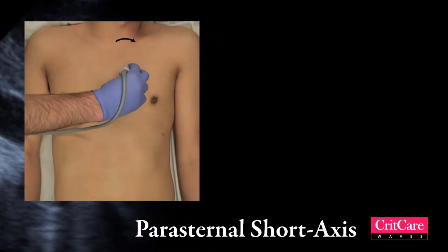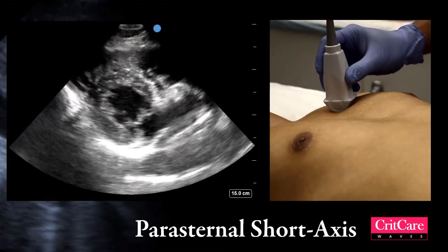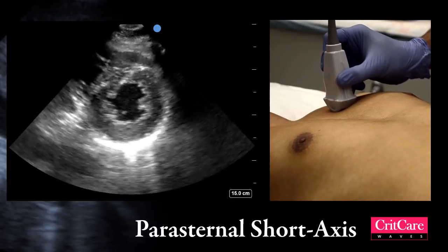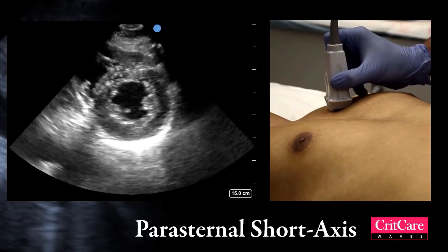Let's move on to the parasternal short axis. To get a parasternal short axis image, find the parasternal long axis and rotate the probe 90 degrees clockwise, so that the marker on the ultrasound probe is facing the left shoulder.